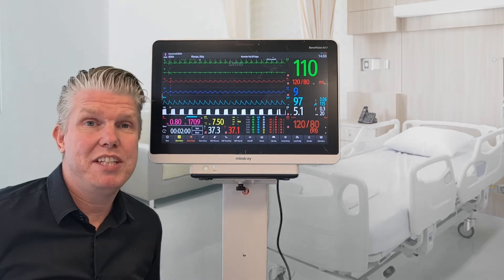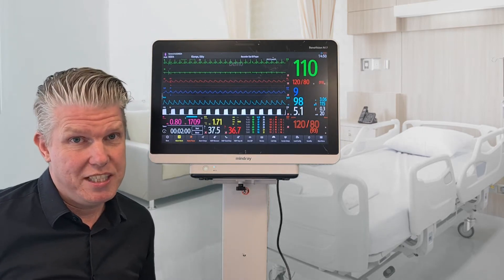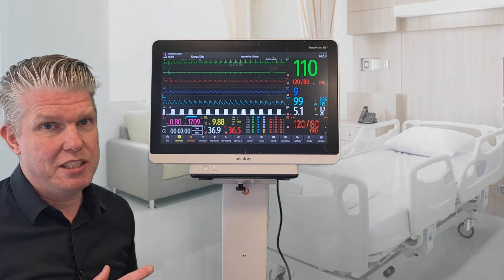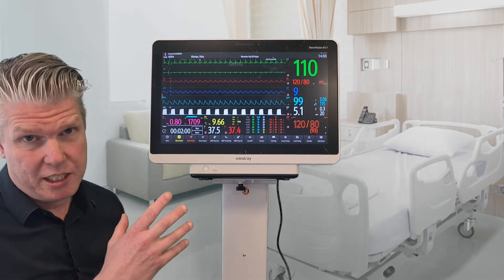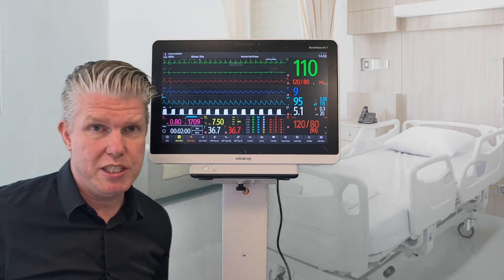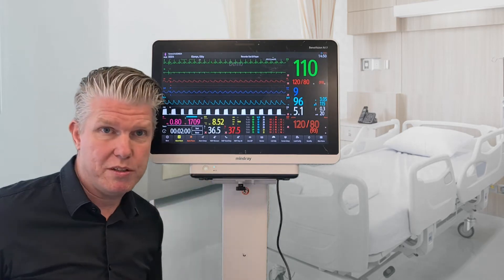Hello, welcome to a new video of IQ Messenger. Today I'm going to show you the integration we created with our IQ Messenger platform and the Mindray machines. In this case we have a patient monitor.